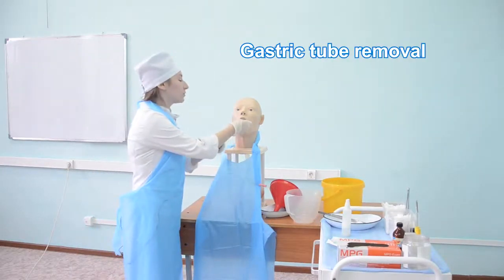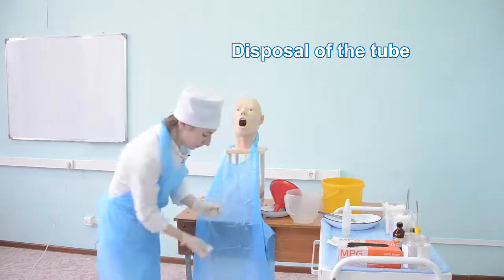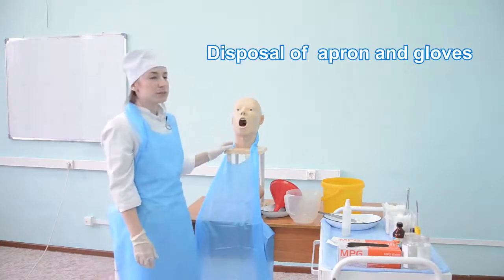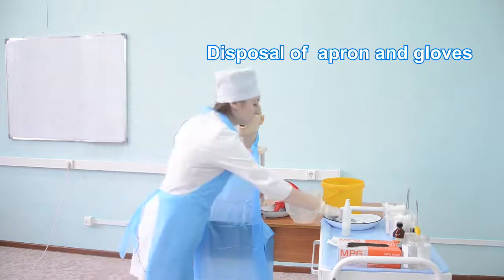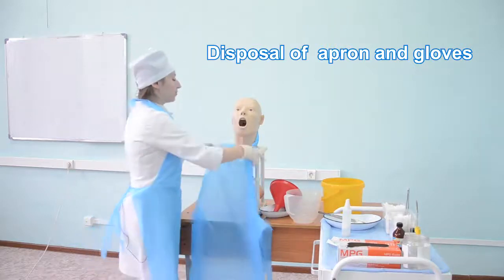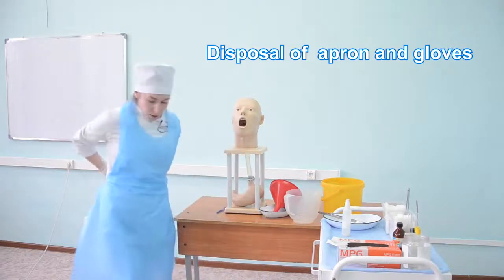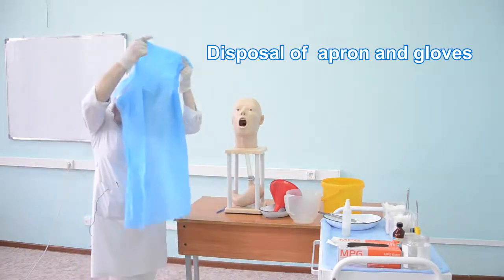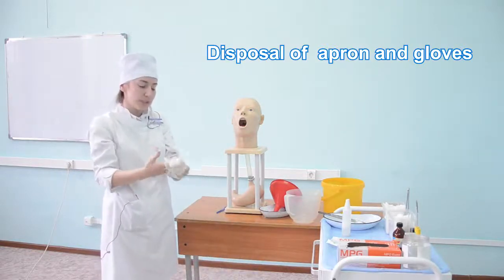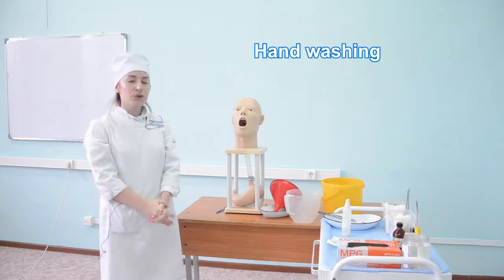Remove the tube from the stomach and place it in the capacity for medical waste class B. Allow the patient to rinse their mouth with water and dry the skin around the mouth. Put off the apron and dispose of it. Remove gloves and place them in the capacity for medical waste class B. Wash hands according to hygiene rules.